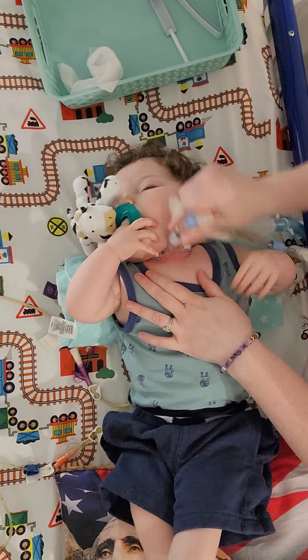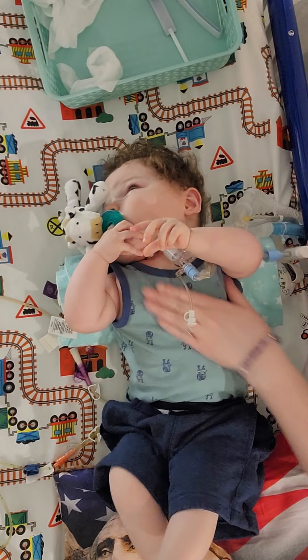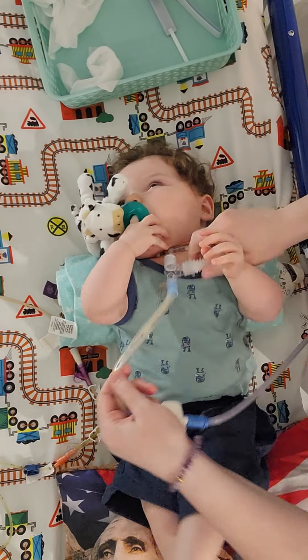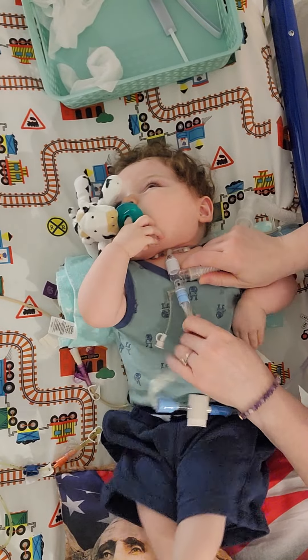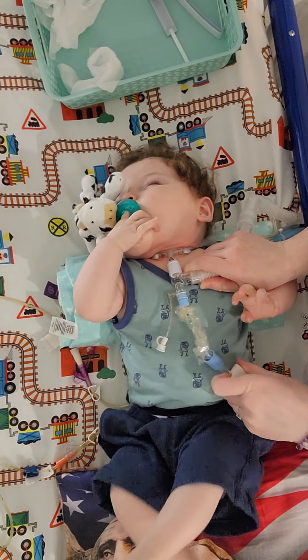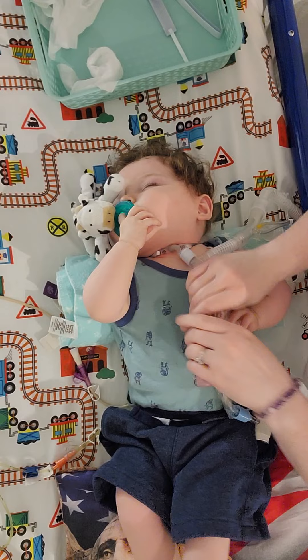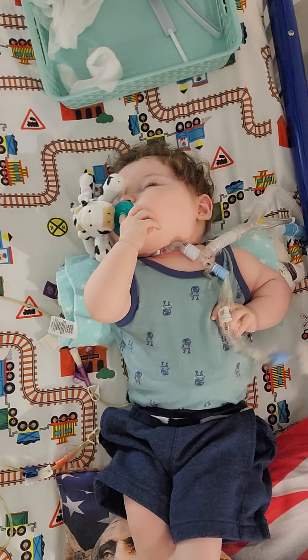Can't really see because the camera is a little far away, but he really doesn't have anything going on around the trach area. I always feel the chest because typically they need to get suctioned, so I'm going to suction. For James, you go down to double green in the first window, and then flush with sodium chloride.